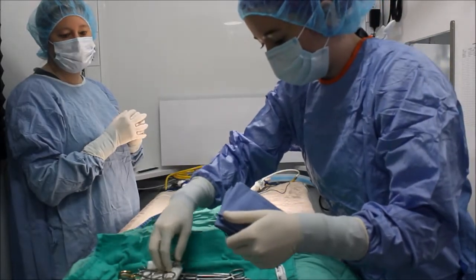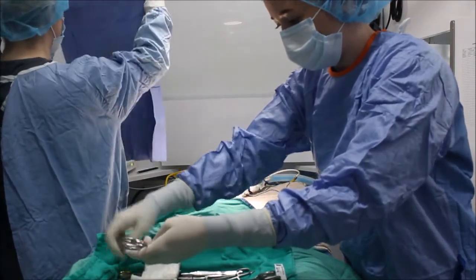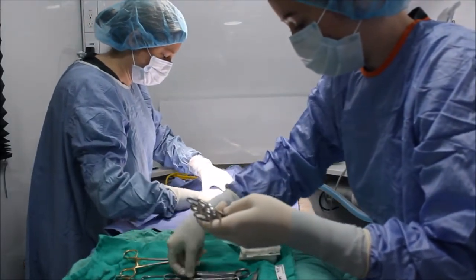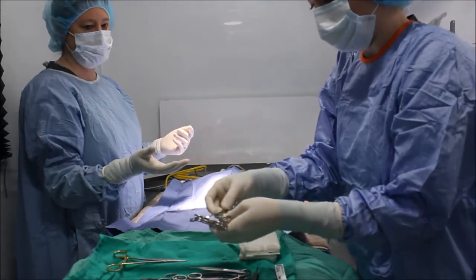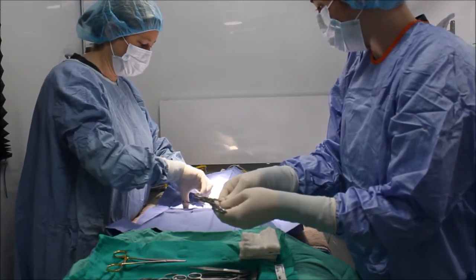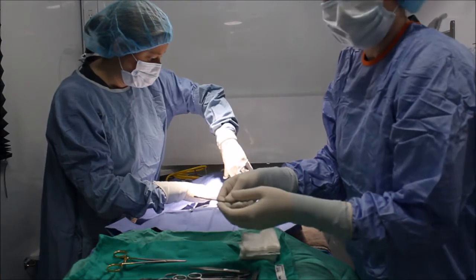Now I'm going to organize everything inside here as my doctor will need it. First I'm going to hand her the drape. Then I'll organize everything so I know where it's at. I'm going to hand her the drape and the towel clamps — I'll leave the ratchets open and firmly snap them in her hand, placing the rings in her hand so she can adjust them with minimal adjustment.